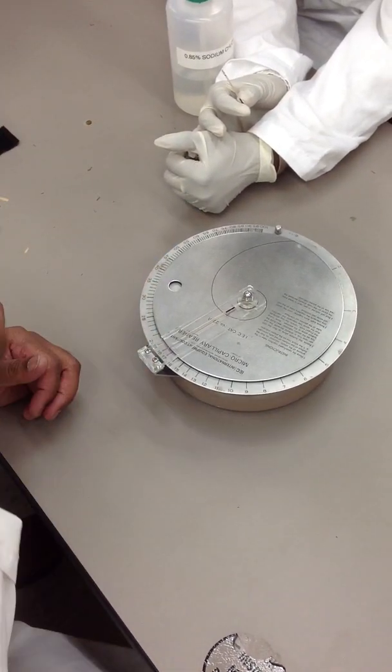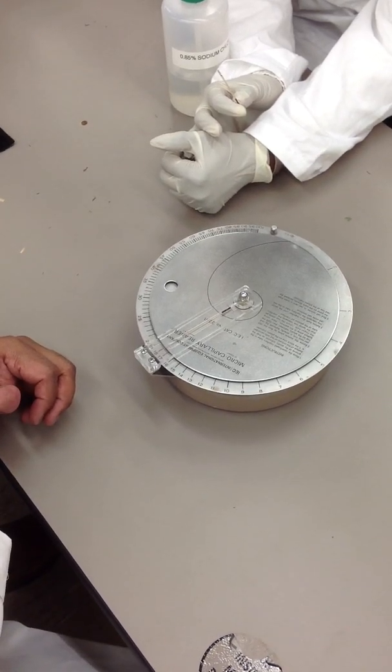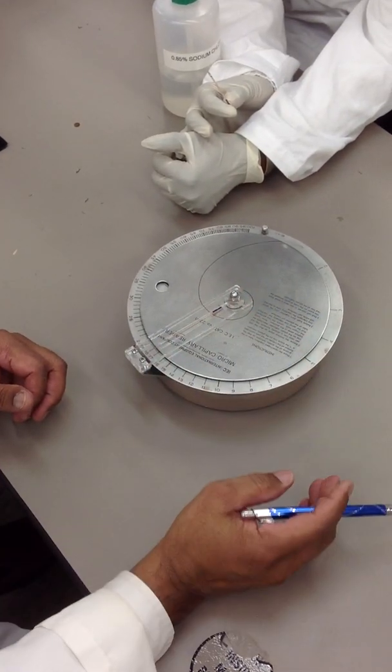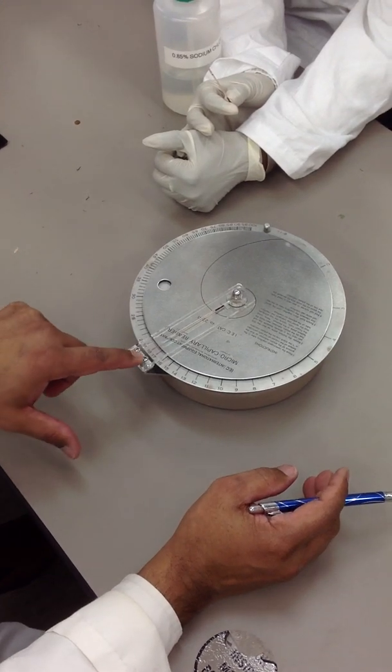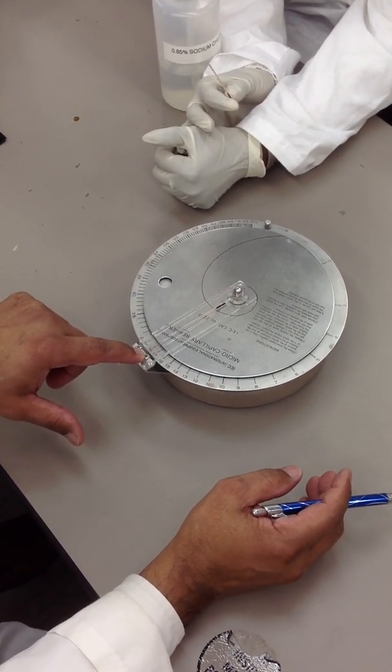And that's because the cell's been there for a while. This is not for hematocrit. But we use it just to practice. Okay? So, this is... That's all you have to do is read the number on the red line. And that's your hematocrit.